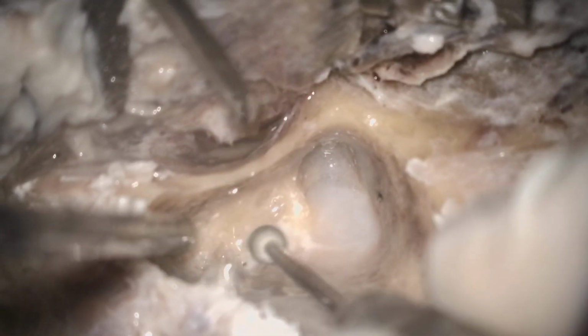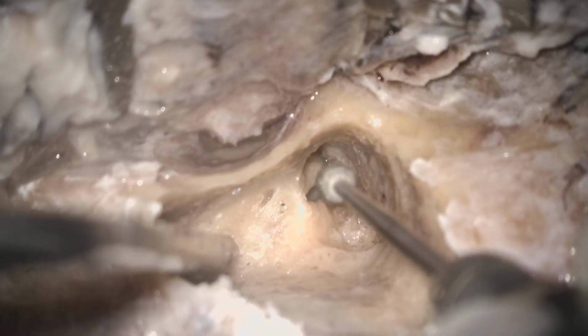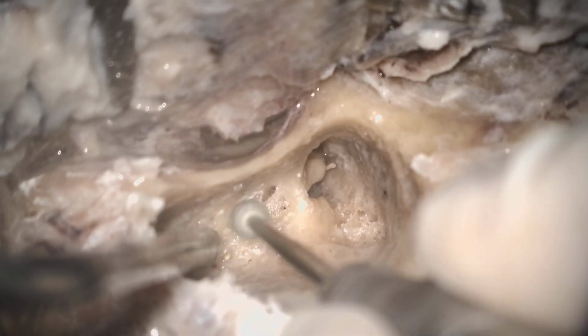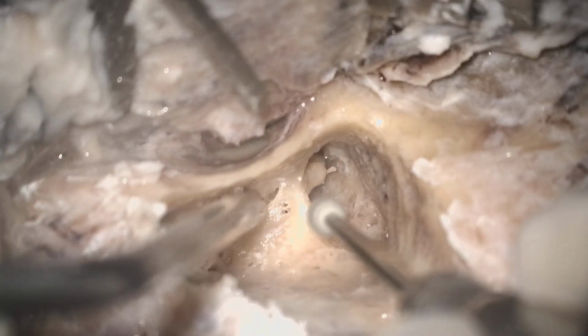So for posterior tympanotomy, this is not necessary, but when you are doing a facial nerve decompression by the transmastoid route, then this approach is very important. So the facial recess approach is needed where? The classical facial recess is for cochlear implantation. Second is the facial nerve decompression.